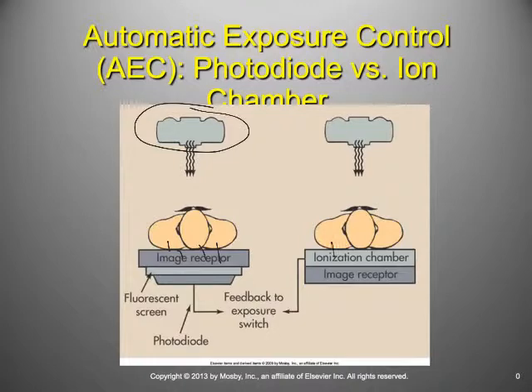And a similar process happens within the CT machine, that it will pass through some kind of ionization chamber or some kind of sensor that feeds back and says, okay, you can stop now. You've reached an adequate exposure, it'll cut the machine off for you. So most of what our X-ray techs are setting now is just an mA, and then they're setting a cutoff amount in the automatic exposure control. So when the automatic exposure control has adequate exposure, it's going to cut it off, right? I'm going to let time sit out here as a variable depending on when it reaches that cutoff point, okay?